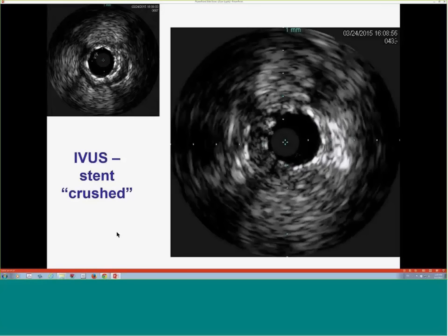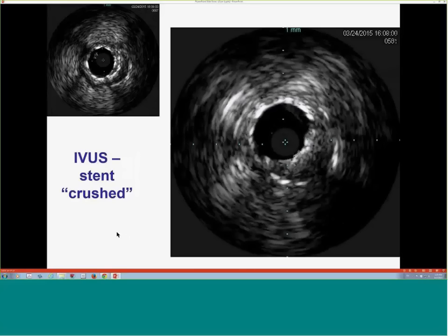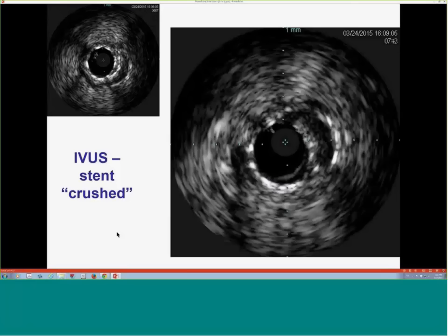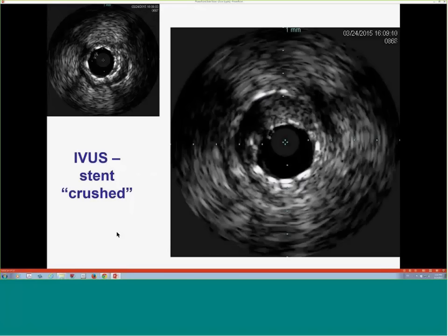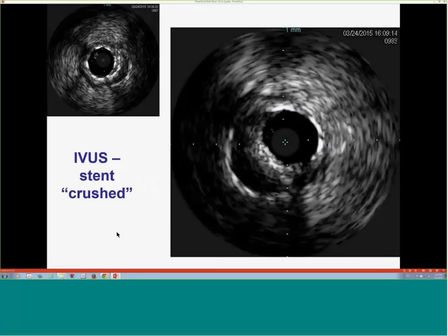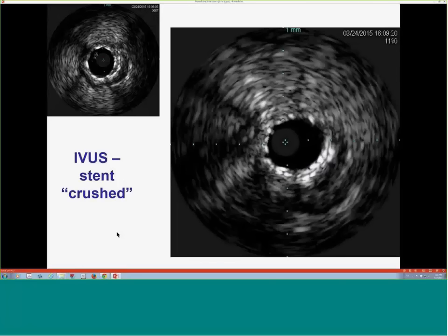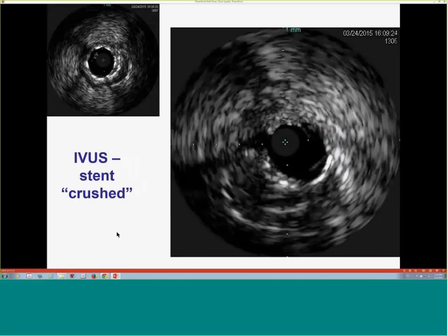But what sometimes happens is you have some focal restenosis, let's say, a focal 90%, and the question is, do you want to know about it before it becomes a CTO again? Yeah, type 4, type 5. Yeah, so I see your point. Yeah, the point is, I think it's occluded. I think we're done. But if it comes back and has a focal restenosis point, then we might consider doing something. Actually, I was thinking for this one, the ideal thing would be to have a covered, a bioabsorbable stent.